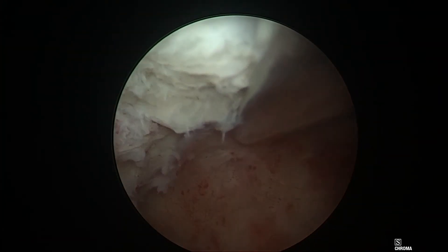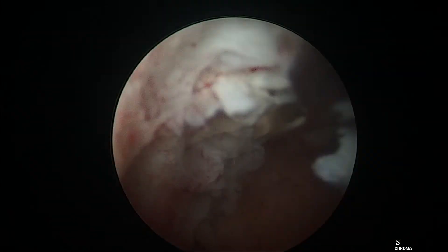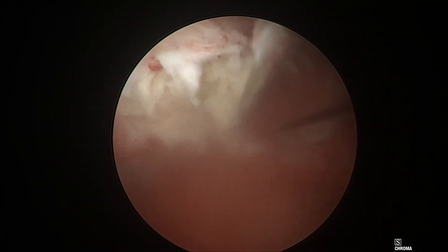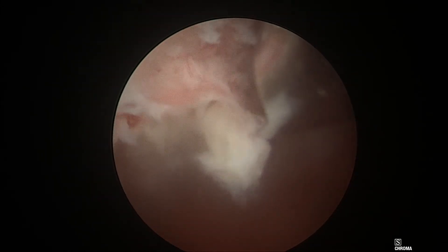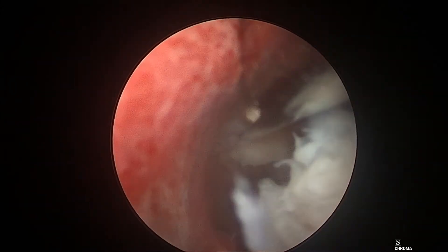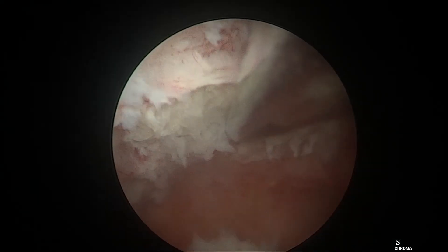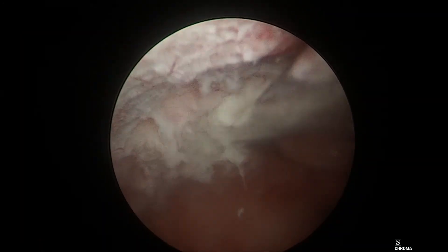Care should be taken to avoid perforation at this stage. We are using normal saline for the entire procedure and a strict input and output was charted. Myosure is a device which works on the principle of morcellation, which is used in laparoscopic surgery.